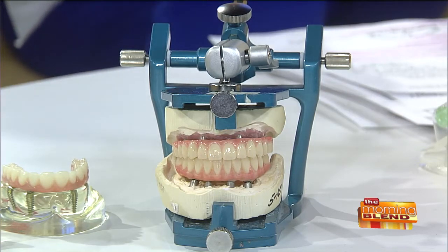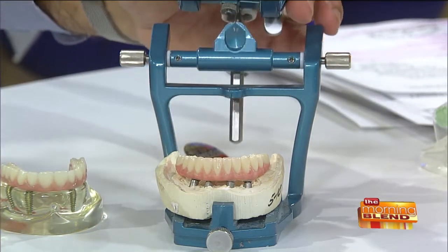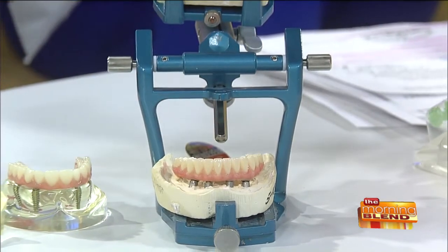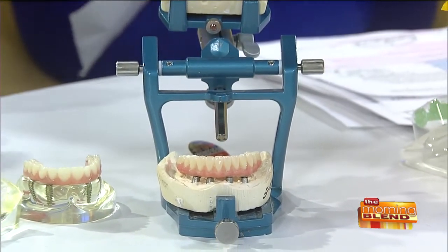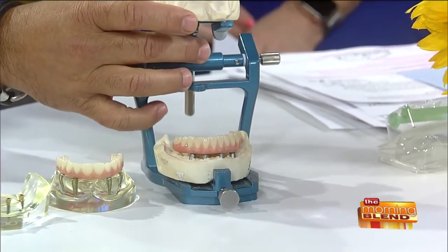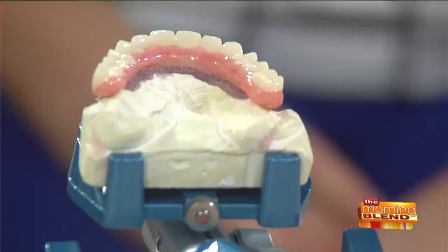What is the full one that we're looking at? This is the exact same case, but from another patient that we had. This is basically another model, and it shows what these look like. Now, these are made out of all porcelain. They really look nice. Beautiful teeth. Yeah, these are made out of denture teeth, and we usually use these as temporaries.